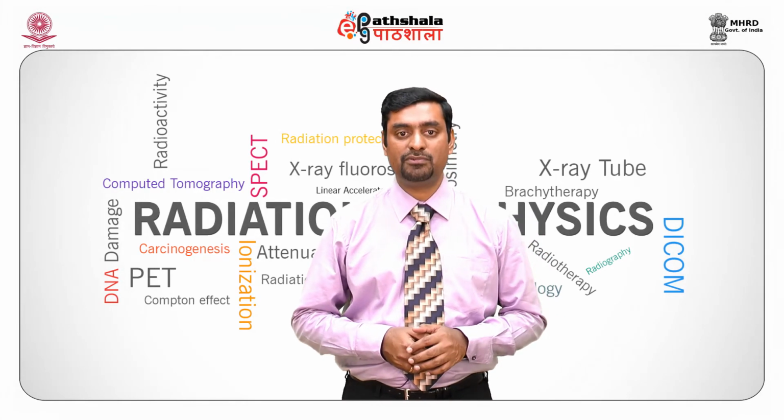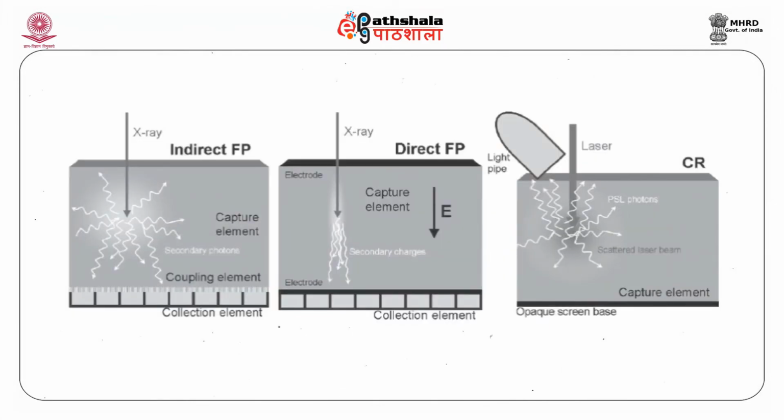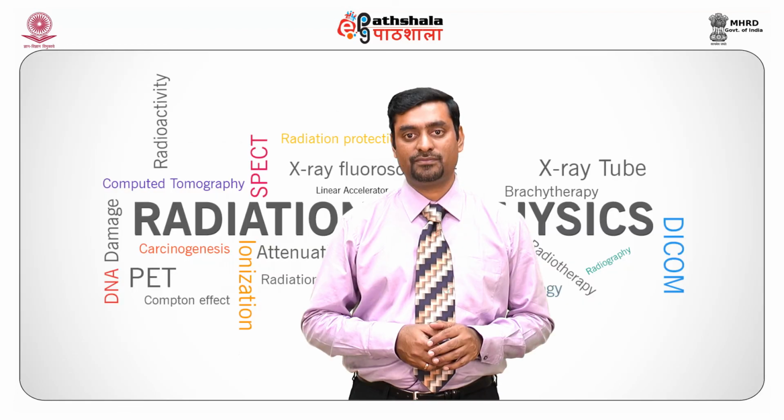And finally, when we summarize, these are the three different types of detectors we see. One is the indirect flat panel detector, a direct flat panel detector, or a CR. These are the various digital detecting imaging systems for mammography purposes.